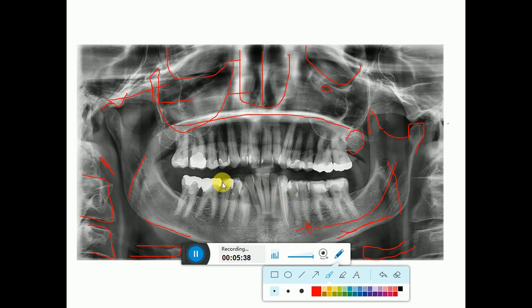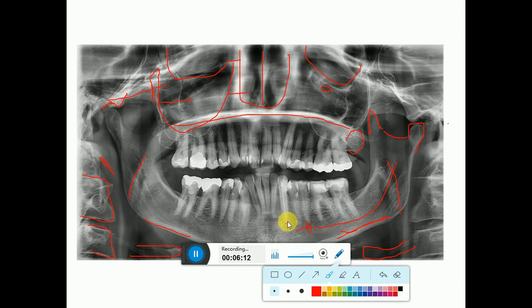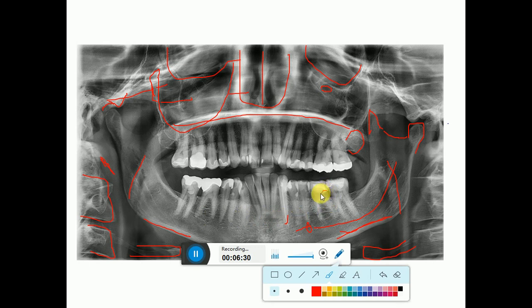Here we can see the teeth, and you can see some look more radiopaque than normal tooth structure — these are restorations. Restorations will look more radiopaque than normal tooth structure. Here you can see restorations on different teeth, even on the mesial side of the lateral incisor and the distal side of the central incisors. Here we have a canine which has had root canal treatment, and you can see the obturation — it is over-obturated because the material exits the apex. This is over-obturation.